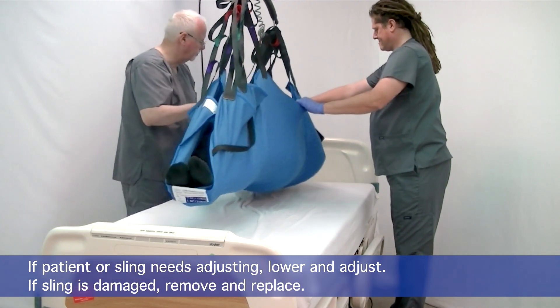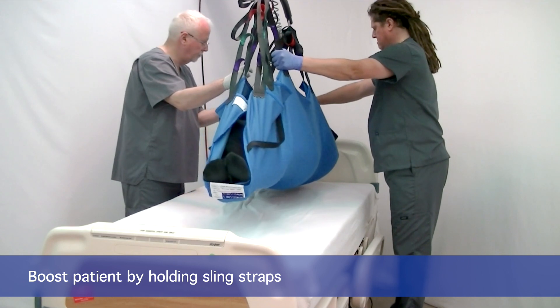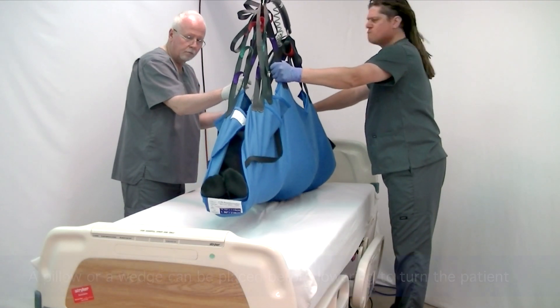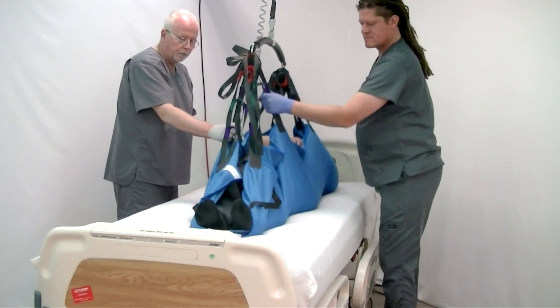So we're going to raise her to clear the bed, use the loops and straps on the sling just to move it, and then we will lower the patient. Of course, you can turn the patient at the same time with a wedge or pillow if you need to.